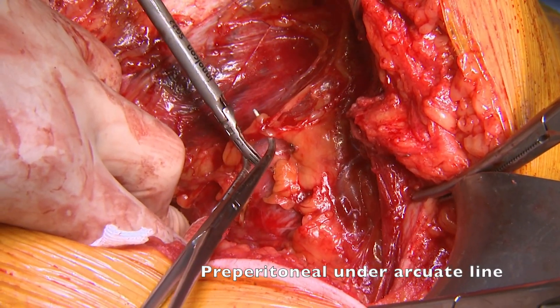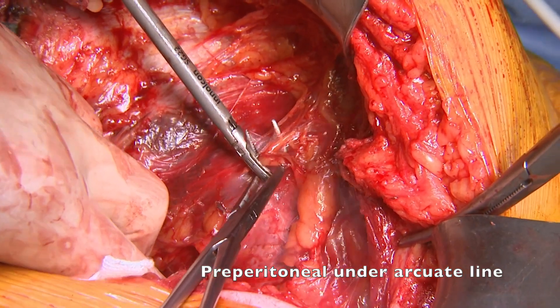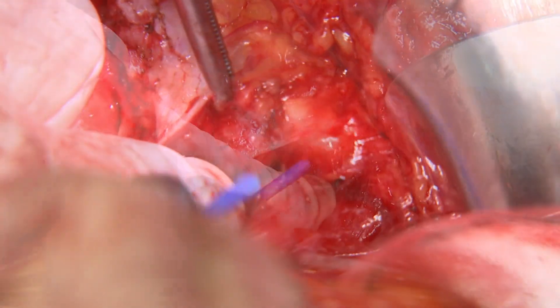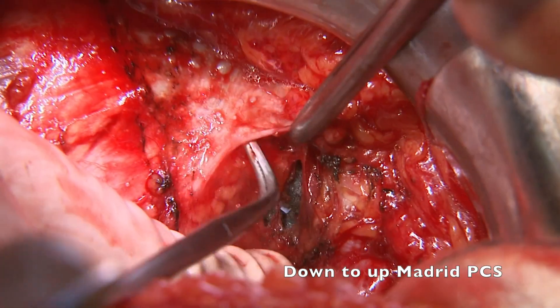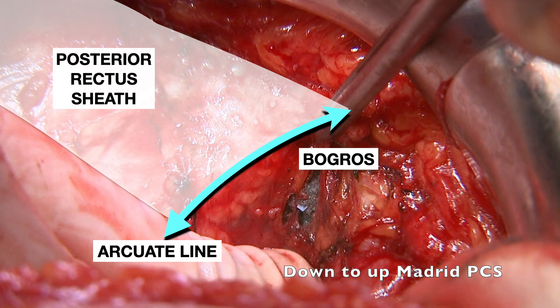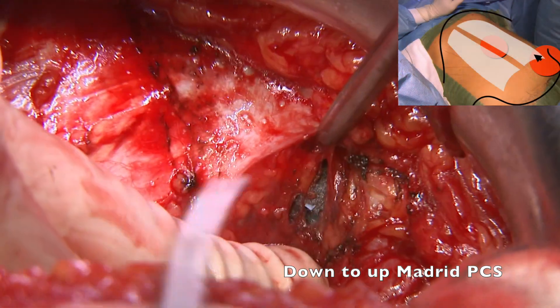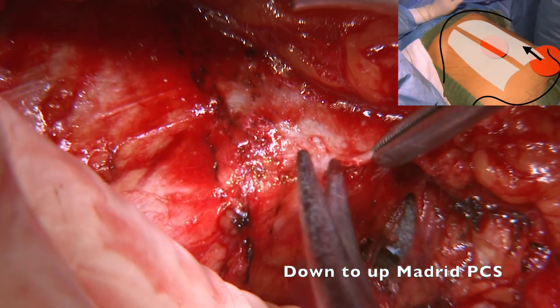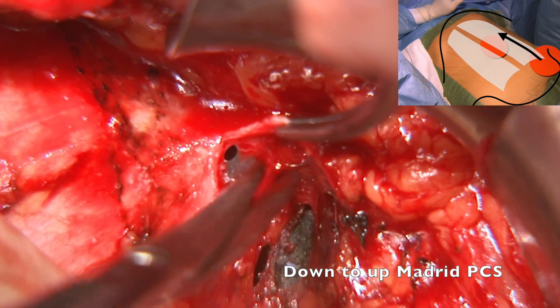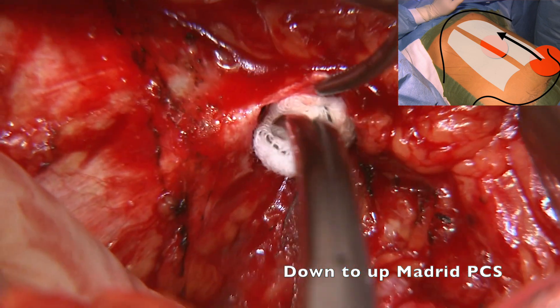Under the arcuate line, it is important to get just over the peritoneum, leaving the fat attached to the inferior epigastric vessels. As the sac and the defect are just starting at this level, and in order to avoid any additional injury to neurovascular bundles, we decided to start the down-to-up posterior component separation. It is important to remember the landmarks of our dissection: arcuate line, Bogros space, posterior rectus sheath, and neurovascular bundles. The peritoneum was extremely thin here and easy to tear. We finally found our way with the combination of electrocautery and peanut dissection.